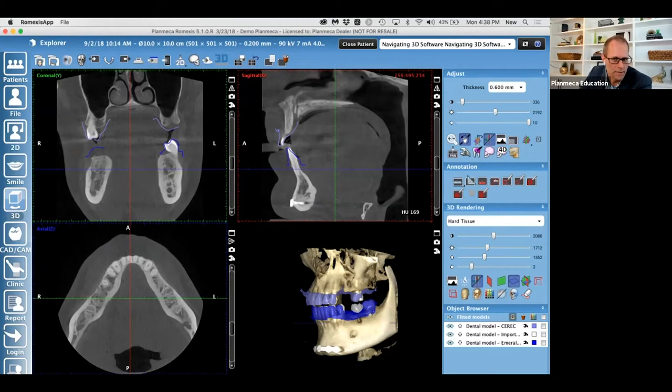So this image here is 10 centimeters deep, and you can see the spine starting right here. You'll notice they started the image way forward of where they needed to. So the operator who took this image took the image over here, and we have all of this wasted data, in my opinion, that is unnecessary.